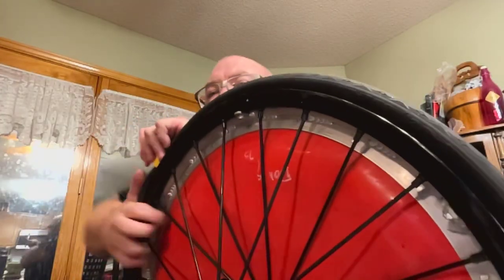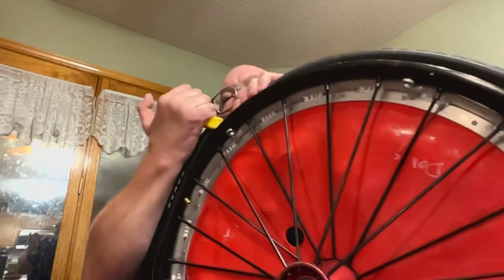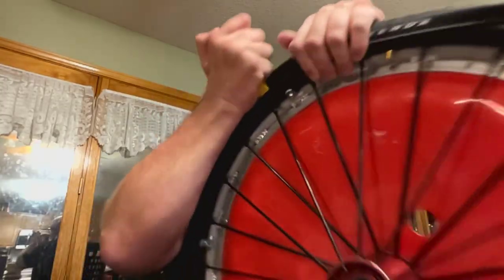Again, I'm a quadriplegic, so I fight with this a lot more than I probably should, but it's kind of fun. It's a challenge. I don't have the best strength in my hands either, so it really does make me work a lot harder than it should. If it doesn't start rolling for me, I go ahead and cup it out a little bit further. I like pulling it this way, so I pull it to my right, just because I got a little bit more function on my right side than I have on my left. And so it makes it just a little easier, but not much.